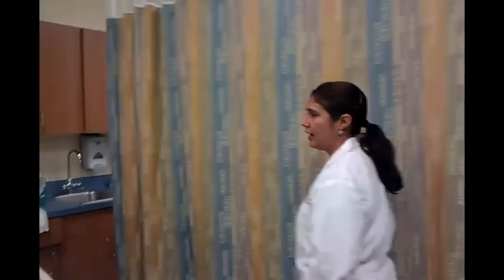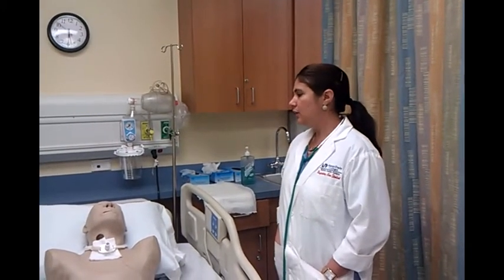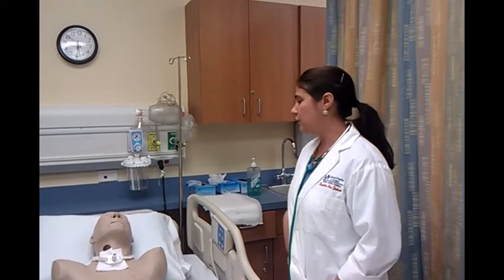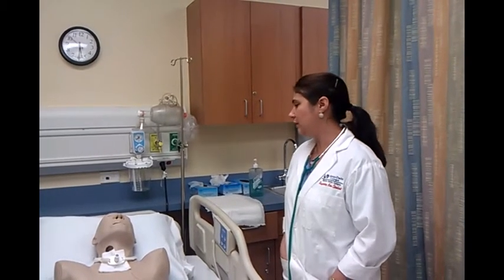Now I'm going to knock on the door and go inside the room. I have to introduce myself to the patient. I am Mileida. I am the respiratory therapist here today. I'm here to do your trachea care because your inner cannula is flooded with mucus and you can get an infection, and that impairs you from breathing well.